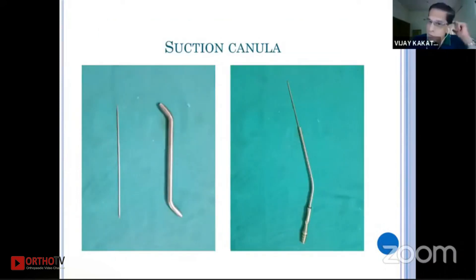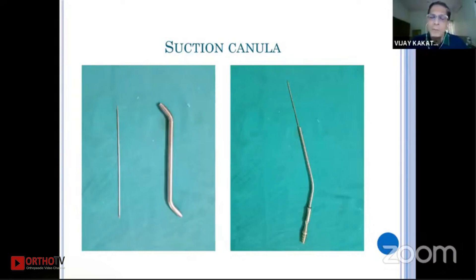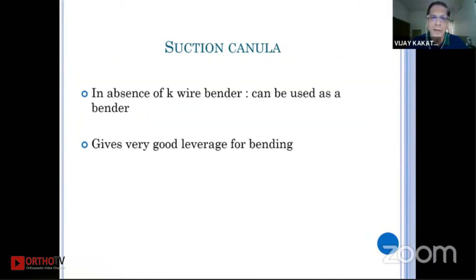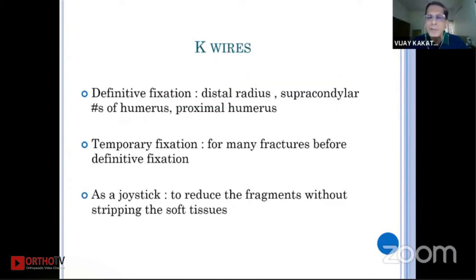A suction cannula can be used as a K-wire bender. Many people use it routinely, but in an emergency if you don't have a Z-bender or other sophisticated benders, this can be of great use.